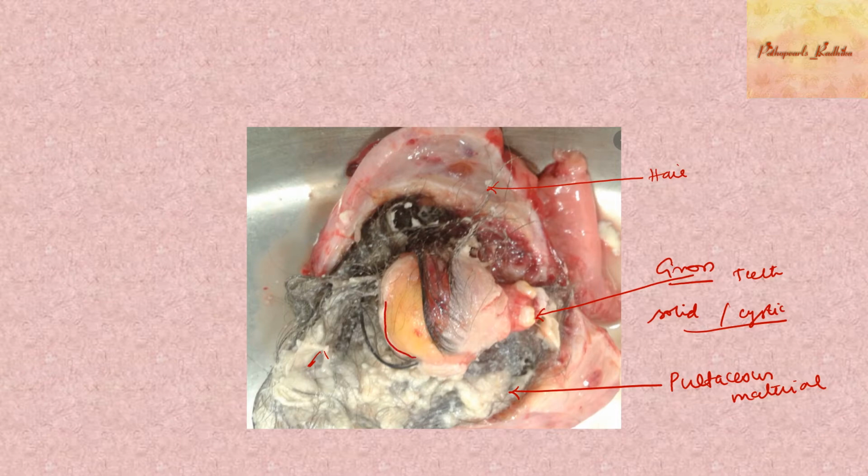And are you able to see this yellow area here? This must be probably your adipocyte when you look under a microscope. And in the gross appearance, what you should know is sometimes it can be predominantly cystic, but you can have some elevated area, a raised protuberant area. That area we call the Rokitansky protuberance.